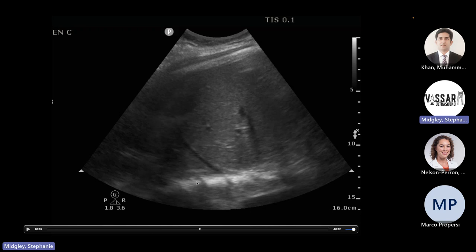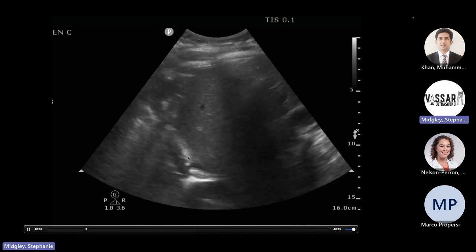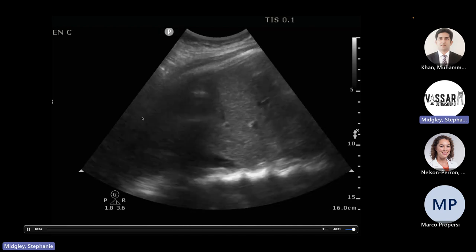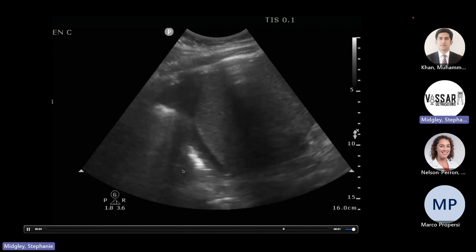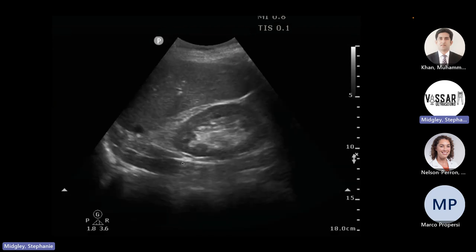And I know this is not mirror artifact because my spine is now above my diaphragm, right? Here's my diaphragm. I can see my trace pleural effusion. And here's my socked in lobar pneumonia. And there's my spine above it. So it's a little bit tricky, but once you slow it down, you can see there's effusion, there's B lines, there's atelectatic lung in there. And then you can get that little bit of hepatization. So this is a sick pneumonia. This is a bad patient.